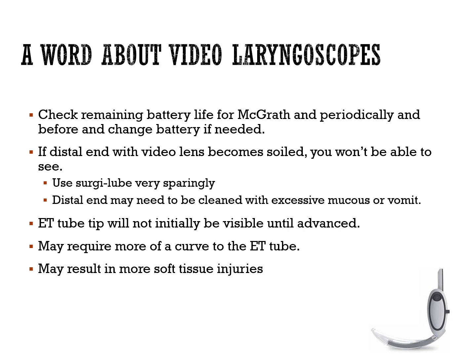In that case, I will tell you that you still have a light source. It's smudged, but it's a light source. You can use the laryngoscope just as the old-fashioned type. It's going to function pretty much the same way, with a little bit more of a curvature, but you should still be able to lift and hopefully visualize the glottis and intubate.